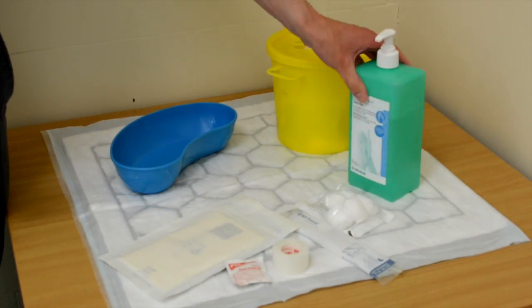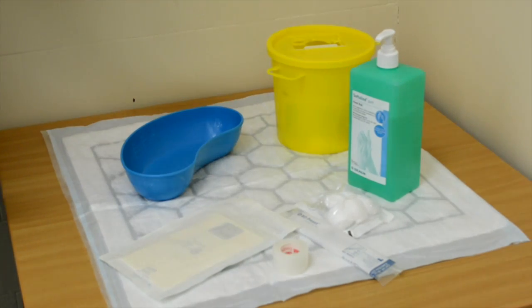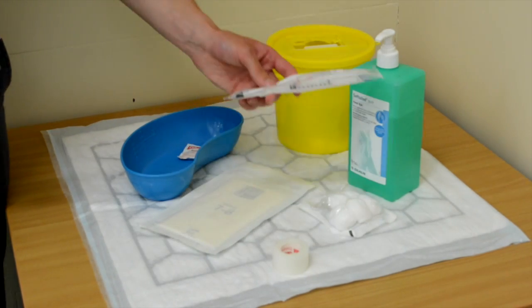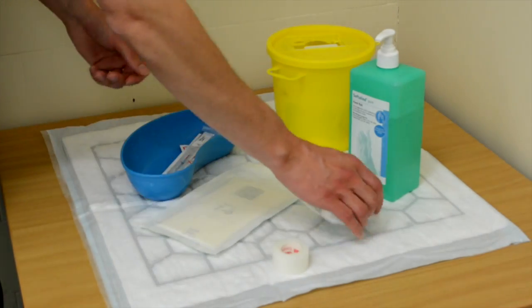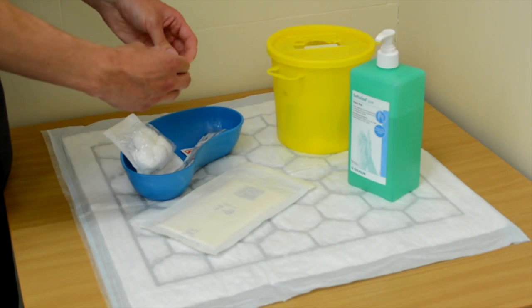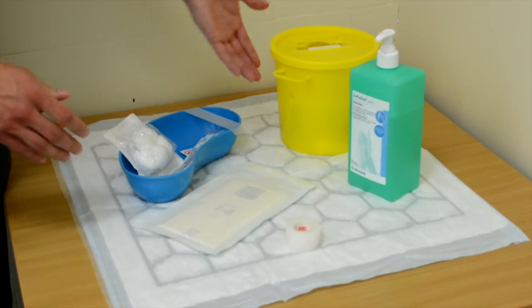So I need some alcohol hand gel, and then in a tray I need something to clean the patient's wrist with — an alcohol wipe. I need my pair of gloves. I need a syringe and small needle with a cap. Then I need some gauze to stop the bleeding afterwards, and finally I need some tape. And of course my sharps bin.